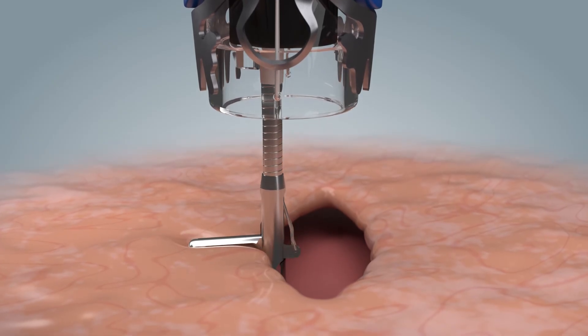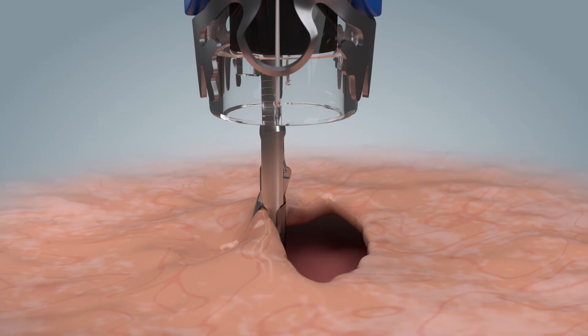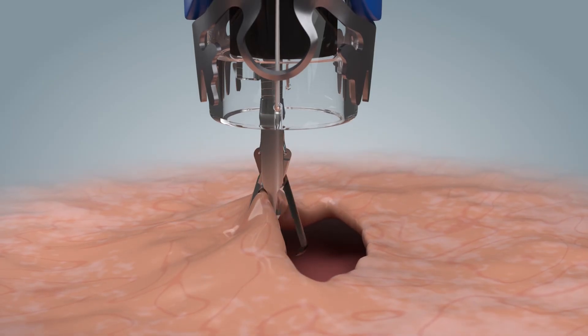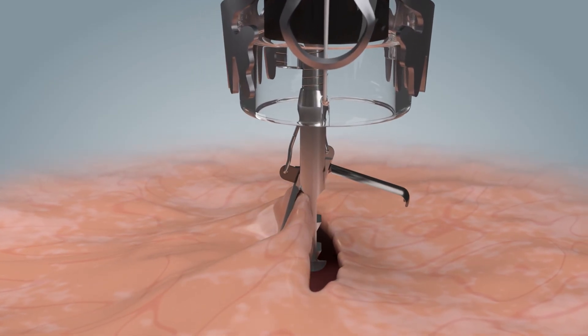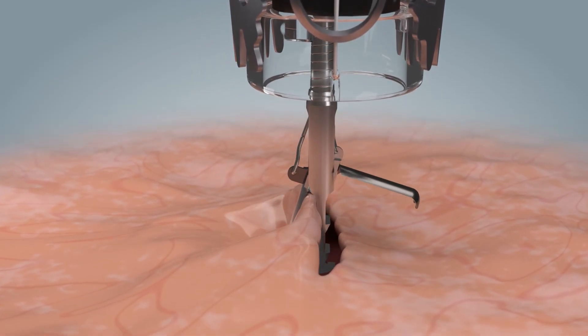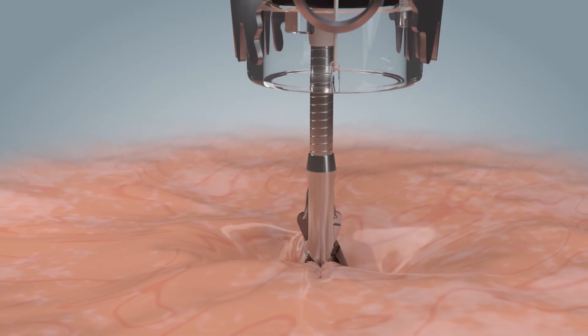First, the first lesion edge is grasped with one of the jaw parts of the OTSC-Twin Grasper. The opposite lesion edge is then grasped with the other jaw part. After mobilizing the tissue in the cap, the clip can be applied.